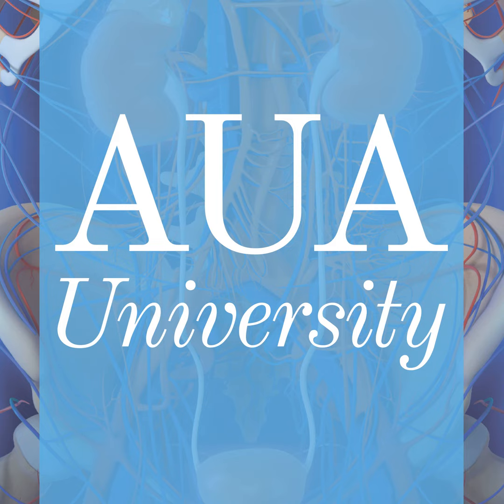What we have seen with PET is certainly we're going to see a stage migration. So we're going to be picking up nodes, bone mets, a lot earlier than we did with conventional imaging. So it's going to look like that patients are surviving longer, where in fact we're picking up the metastasis a lot sooner. And prior to any of this molecular imaging, you can see the distribution of metastatic sites in patients with recurrent prostate cancer was the bone, because we did bone scans as the PSA were rising.